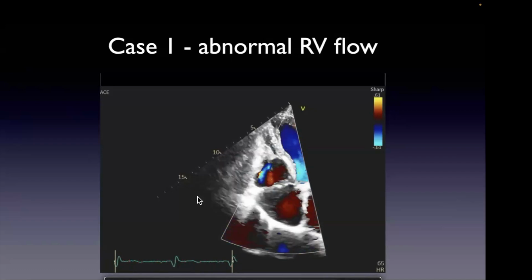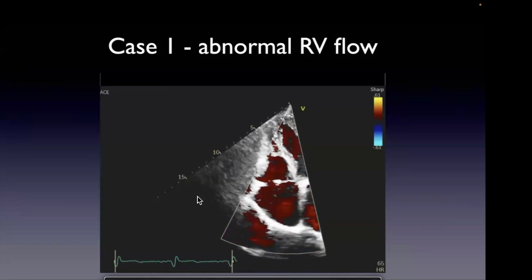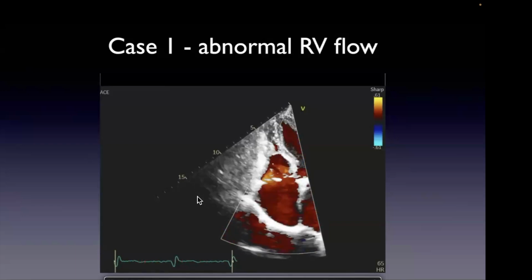Of course, we have the ability to slow it down and look at it in relation to the QRS complex. But as I tell the fellows, the experienced sonographer and reader doesn't have to freeze and scroll, but the more novice readers will have to. It's particularly more challenging when the patient's tachycardic, of course, because the cardiac cycle is short.